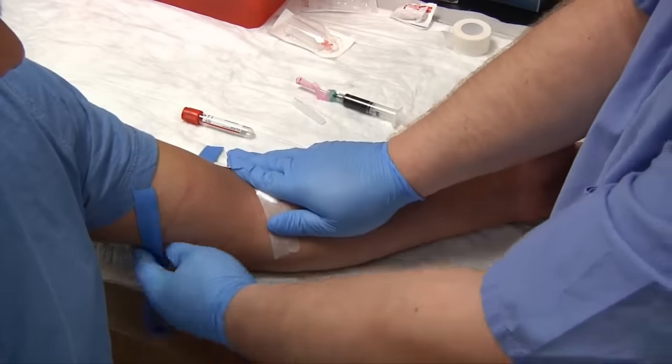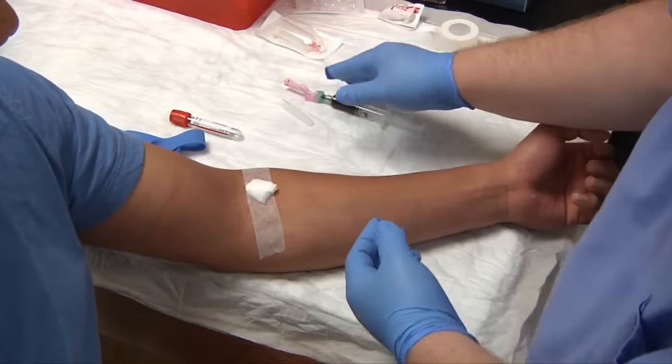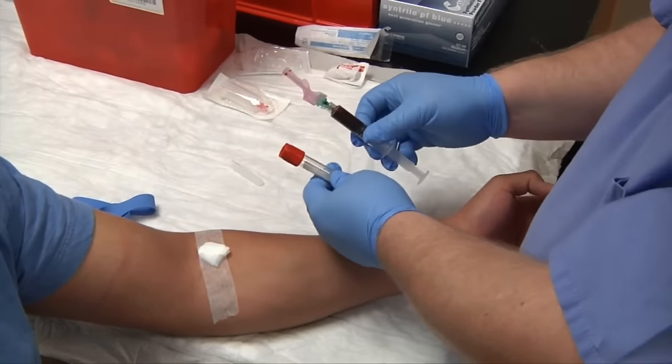We have our patient bandaged. Now the next step — since we drew this into a syringe — we need to move it from the syringe into the evacuated tube.